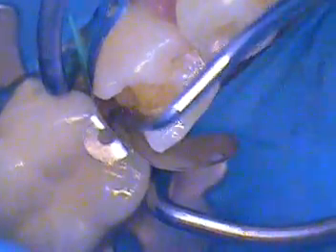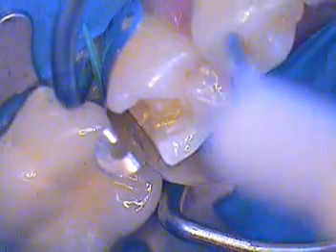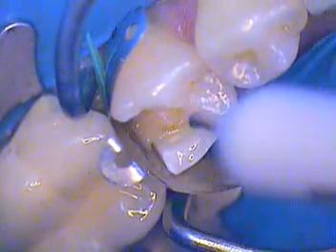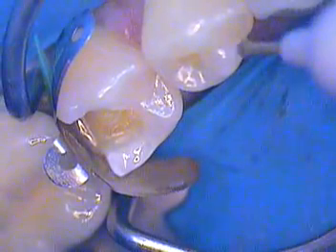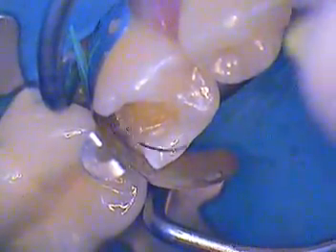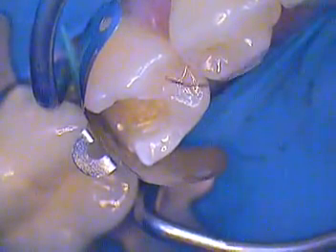You want the patient not to catch chicken or any other foods that will stick in the area — I want that all clear. That looks great. We'll go right in with our flowable. I like the posterior flowable — just a small amount in the gingival area. Maybe we can plug some of these small little pits with the same material. I like to use an endo file for some of this. I just want to make sure I'm not trapping air — take a number 10 file, just making sure we don't trap air. Leave the tip in there and wiggle it.